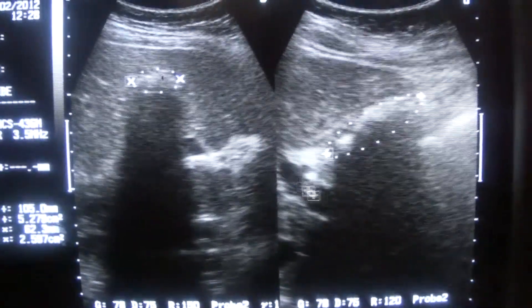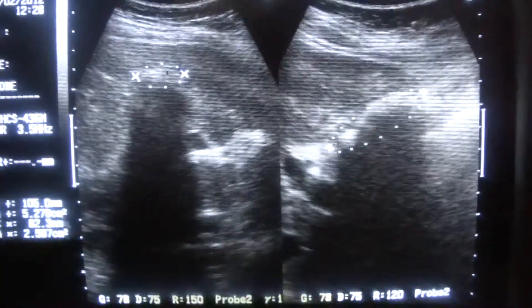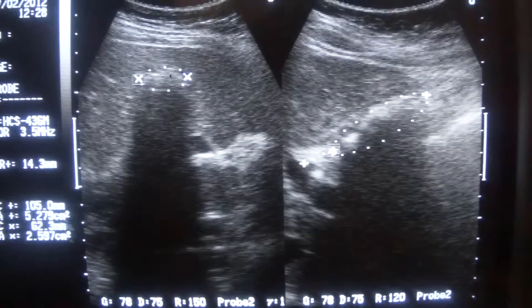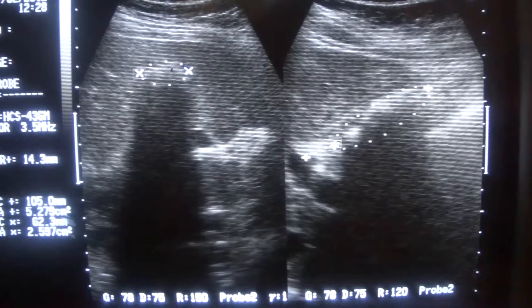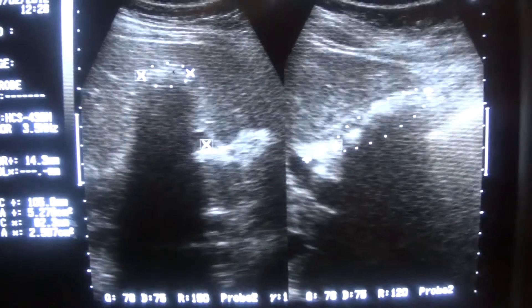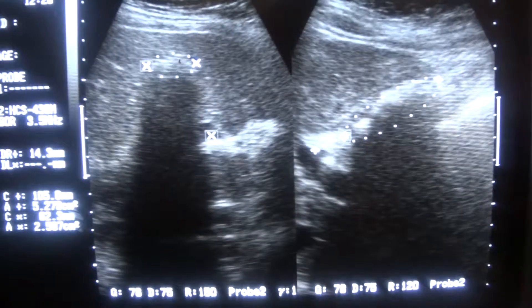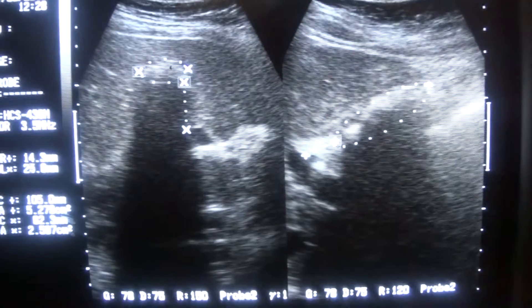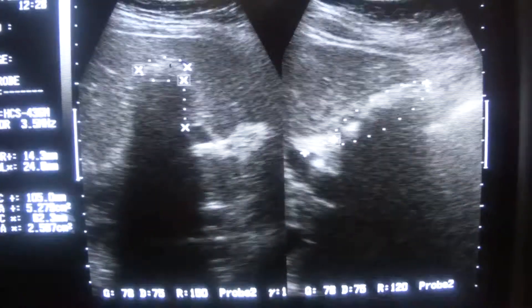If you see, this portal vein is at right angle to the posterior part of this echogenic area. In this image, this is the portal vein. So the relation of the portal vein is at 90 degrees from both echogenic areas.